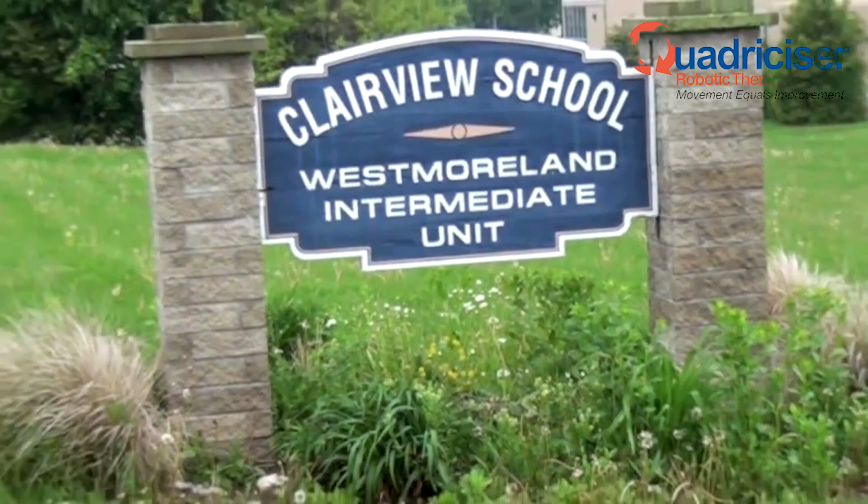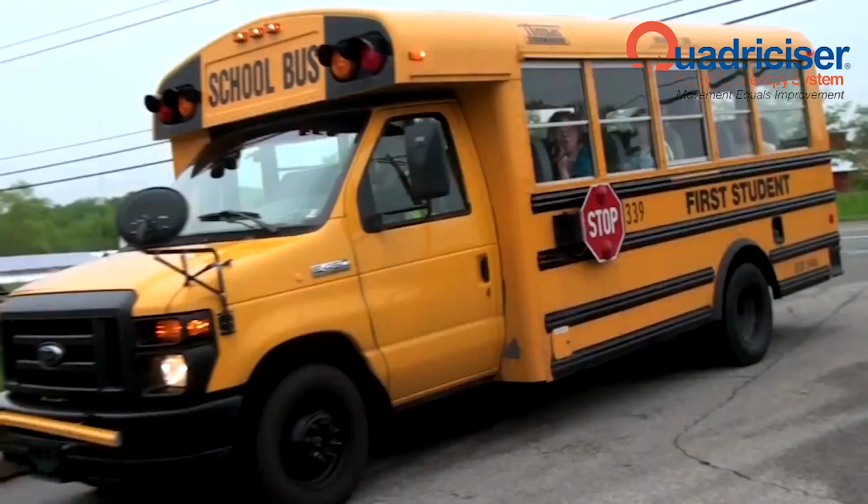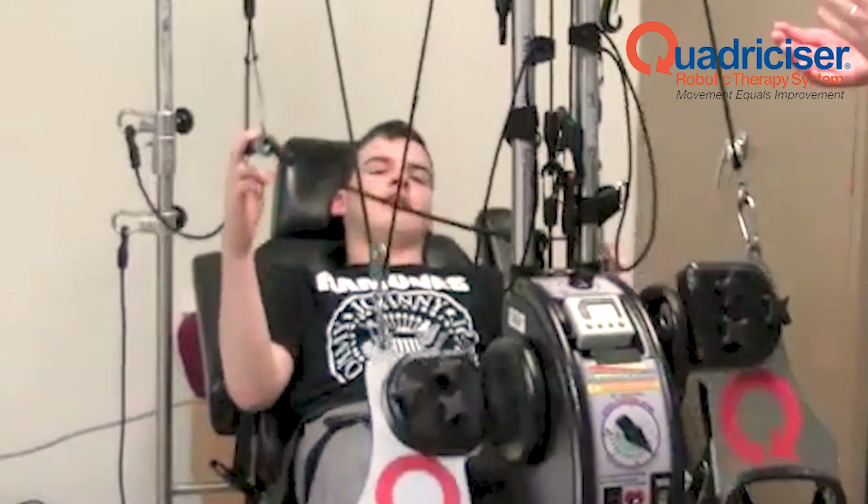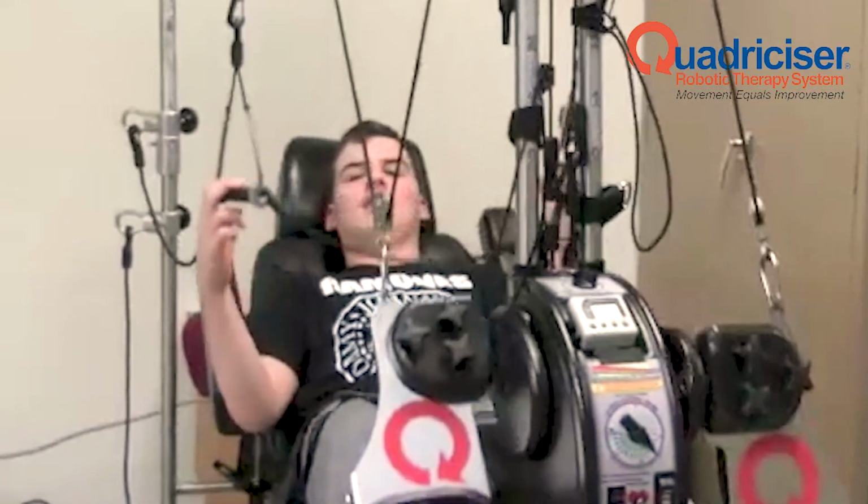With some of our autistic students, we use it to help self-regulate, maybe when they come in off the bus and their behavior's a little bit more hyper. We put them in the quad and get that movement at a fast pace, and it helps regulate at a comfortable pace for them before returning to a classroom where they're more attentive to sit and listen to the teacher. You're saying it helps their attentiveness? Yes, it does. They seem more calm when they're back in the classroom.